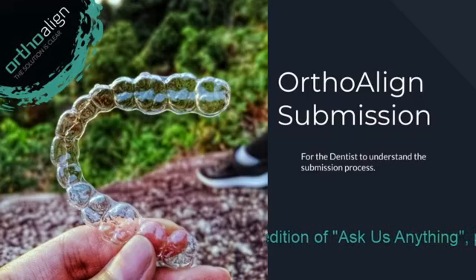Then the next thing that we're going to go to is, of course, like I explained in the beginning, we're going to need your impressions, your X-rays, and your intraoral photos. And of course, on top of that, you're going to need your RX form as well. So earlier, like I said, the four things that you're going to need in order to submit a case for OrthoAlign. Then the third thing that we have in the workflow is case submission. Once you have all of this data and information together, you will then submit your case to us.